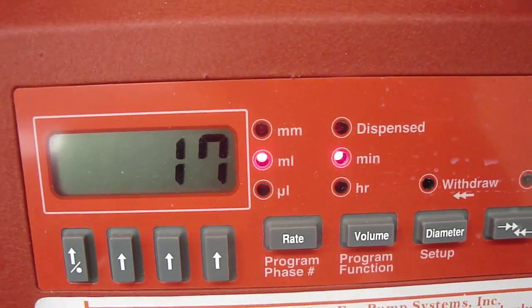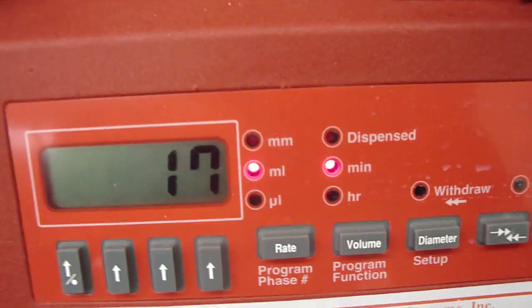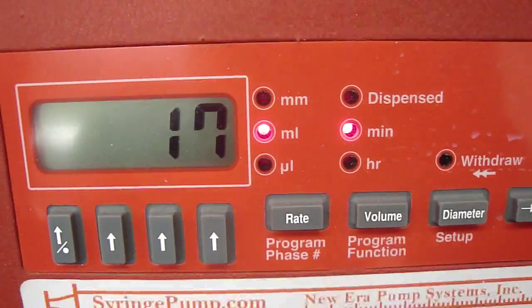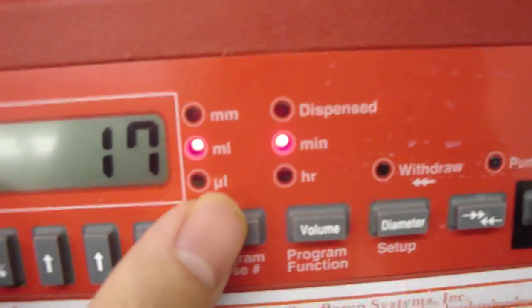Hold it there for three seconds and the rate is set. And if you want to change the unit of the rate, you can press the rate button.